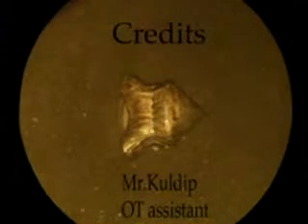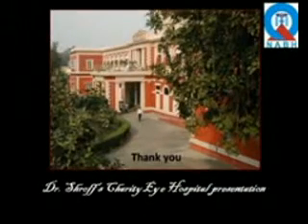This is the large conical metallic intraocular foreign body removed from the left eye of this patient successfully. Thank you for your patient hearing.